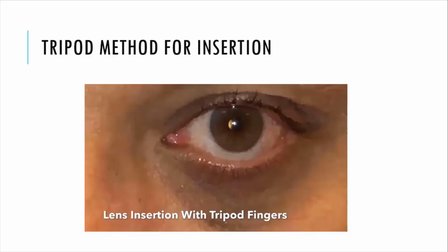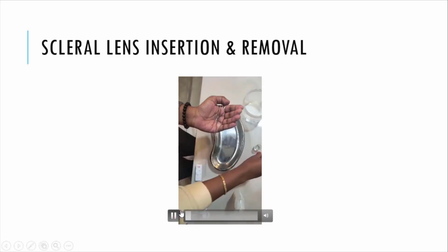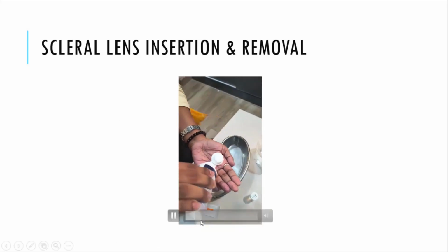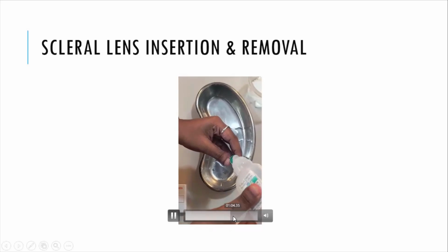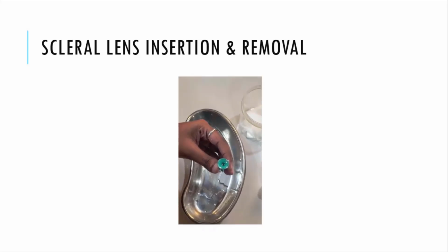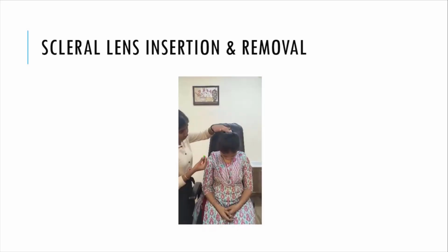The lens should be filled up to the brim, or a little more than the brim. And this is the other variety, but the patient usually feels it much easier to handle, because they have an aid with the plunger. So always the cleaning of the lens is insisted. After cleaning the lens, with the plunger, putting a little drop of saline in the plunger, the lens is fitted, and then the normal saline or the preservative-free saline is filled in. And when we are examining, we put the fluorescein into this fluid, and then check for the clearance while doing the trial fit for the patients.